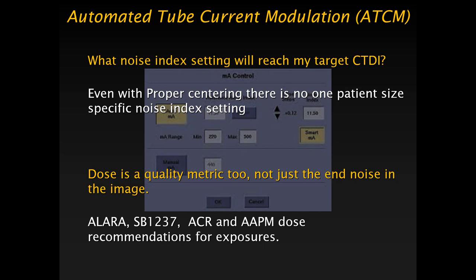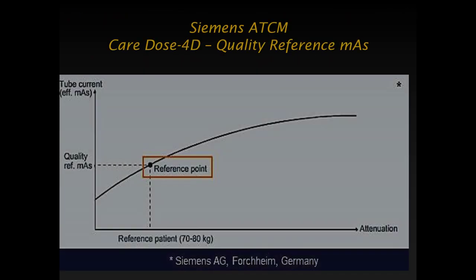If you're practicing ALARA and image gently and image wisely, and you look at the ACR and the AAPM, they all have recommendations for exposure thresholds. They're all looking at, well, what's the right exposure for your patient? And there are ways to do this.